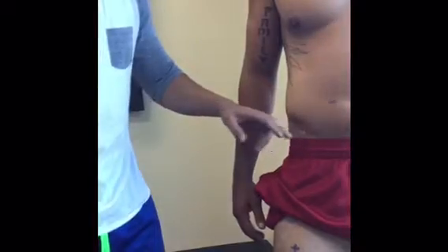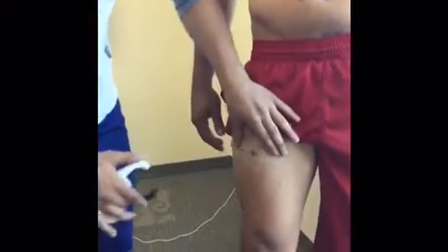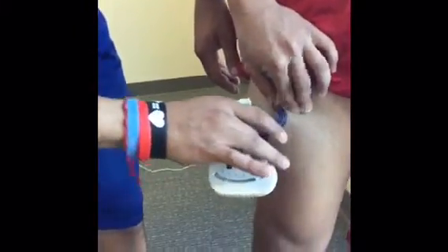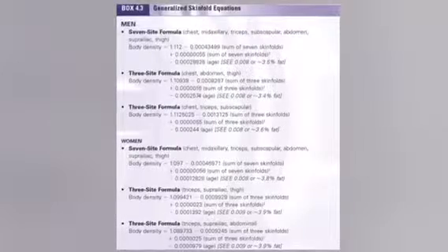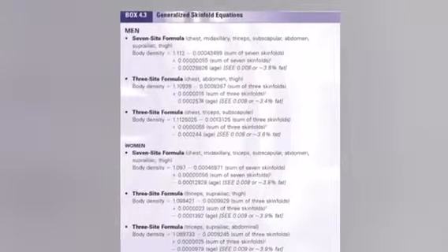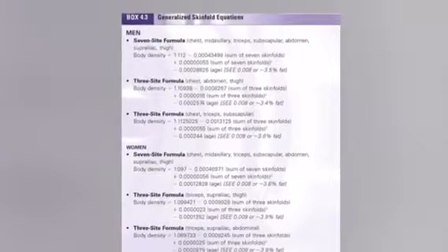Okay, so assessing the 7th site, it's a vertical fold. It's between the hip and the patella. So got a nice good chunk right here, and we got a reading of 10. After the 3 trials of the 7-site skin fold test, you will average out your scores and plug them into these formulas according to gender.